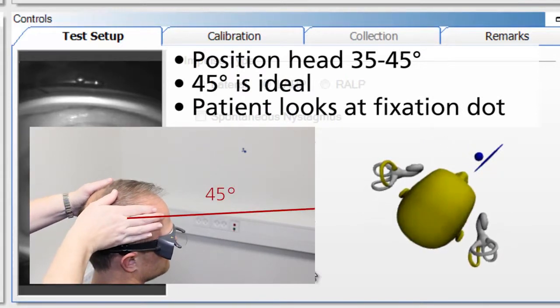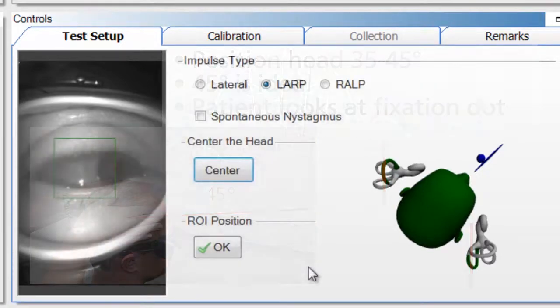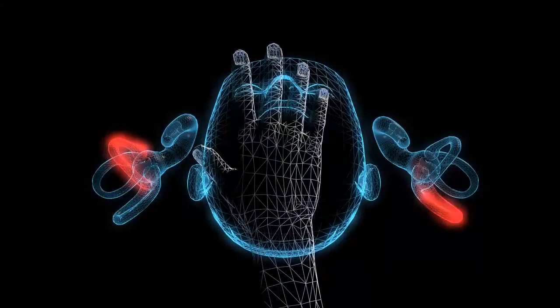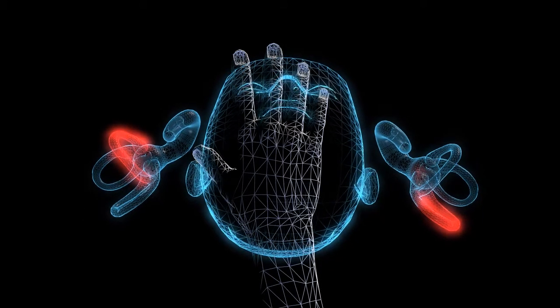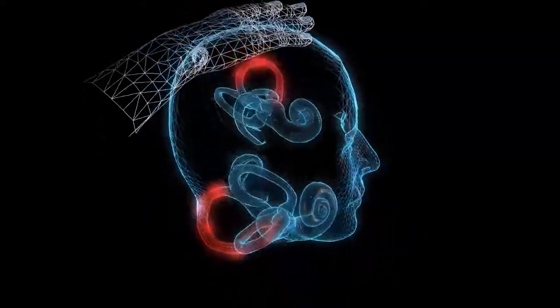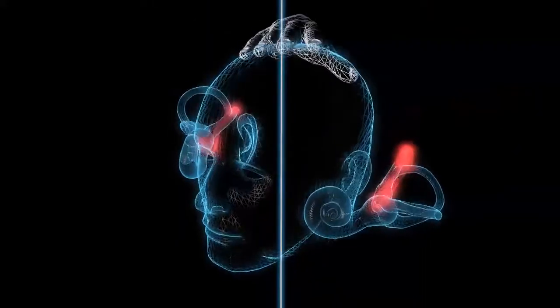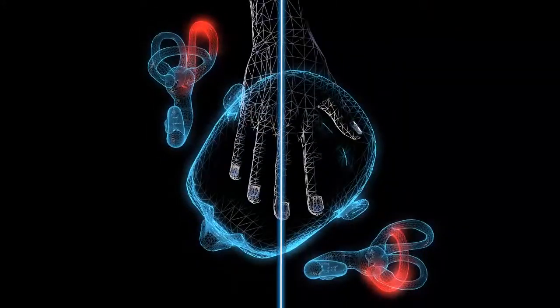This is easy to remember: LARP starts with L, and you want to do the opposite of the first letter, so you turn to the right. By turning to the right, you're lining up the left anterior canal towards the fixation dot, and the right posterior canal towards the fixation dot. When we move the head to the right, we're making sure that our head impulses are a pure pitch motion and not a combination of pitch and roll, which makes it a lot easier to perform your head impulses accurately.